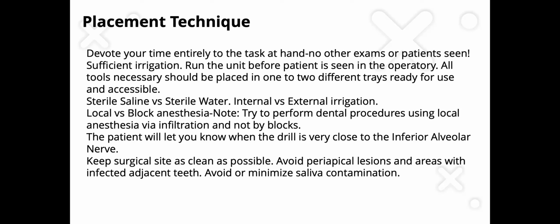Keep the surgical site as clean as possible. Avoid periapical lesions in the adjacent teeth areas with infected adjacent teeth, and also avoid or minimize saliva contamination in that area.